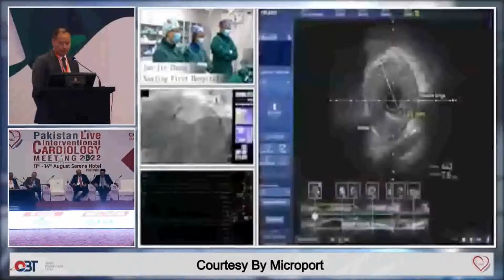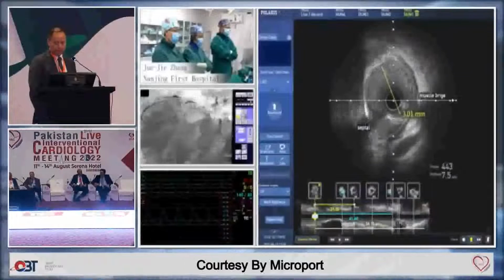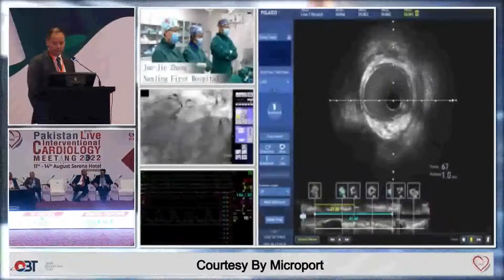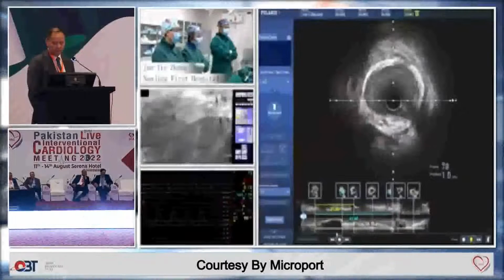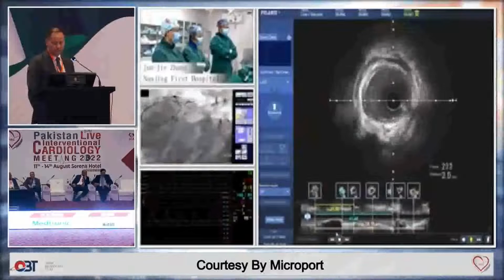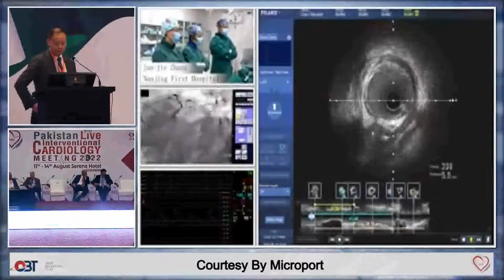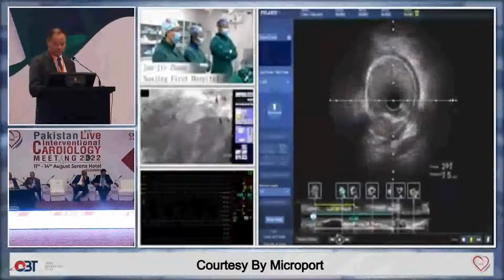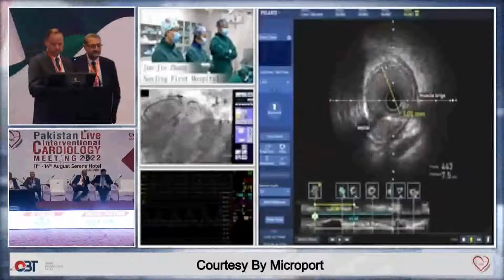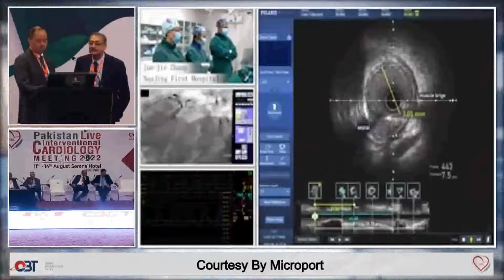Yes. Okay. Hello, everyone. Can you see the IVUS imaging? Yes. Okay. Let me show the IVUS imaging. The first round, we check IVUS from the distal LAD to left main. And here, the distal LAD is normal. And here we can see the muscle bridge. And going back, we can see the septal joining the LAD. And then here, it is the distal septal. And here the vessel diameter is about 3.0 millimeter.